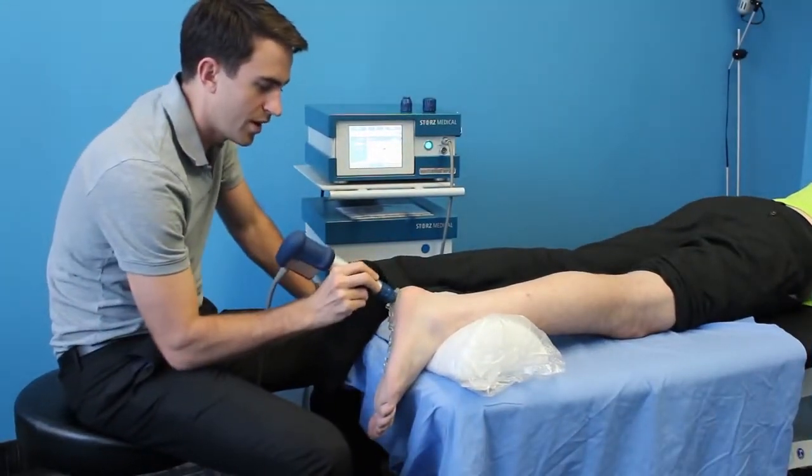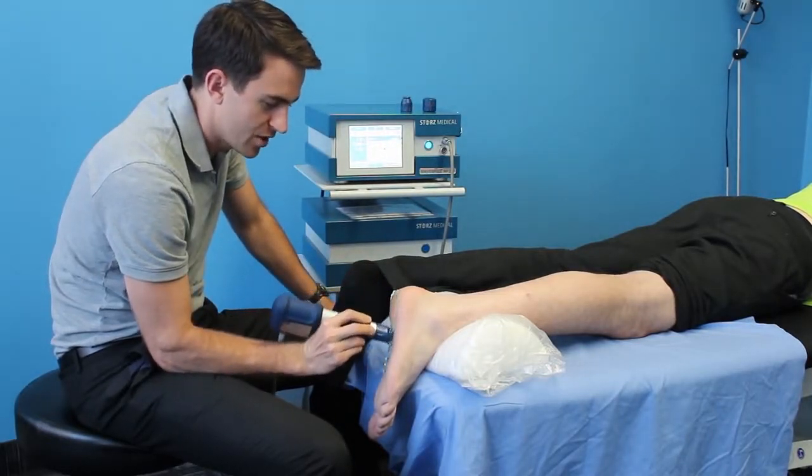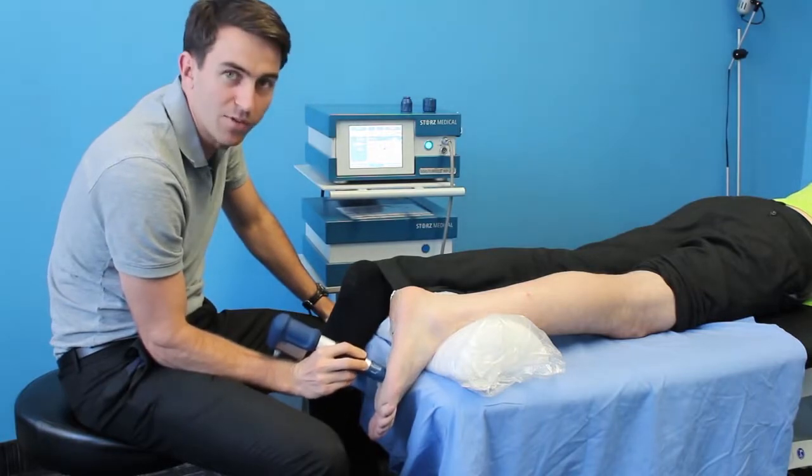So with this treatment, we're going to work here from the calcaneal tuberosity up through the central part of the fascia, up here to where it starts to split to each of the five toes.